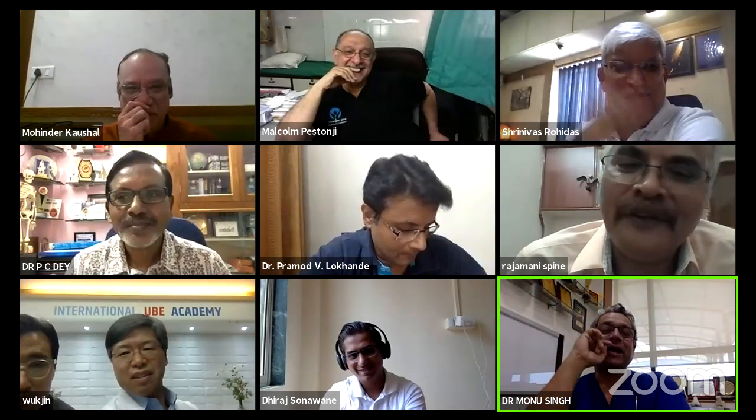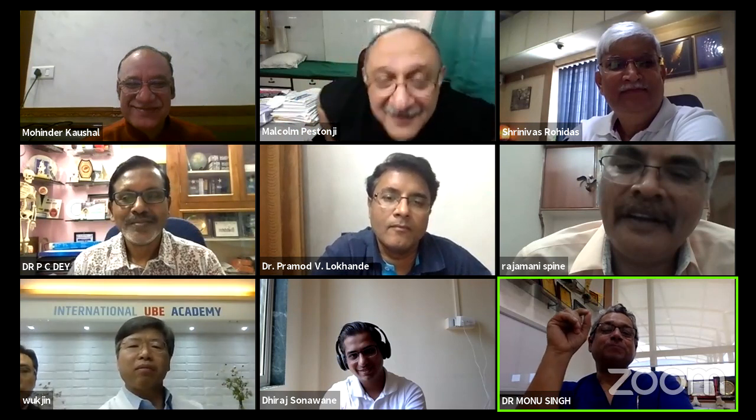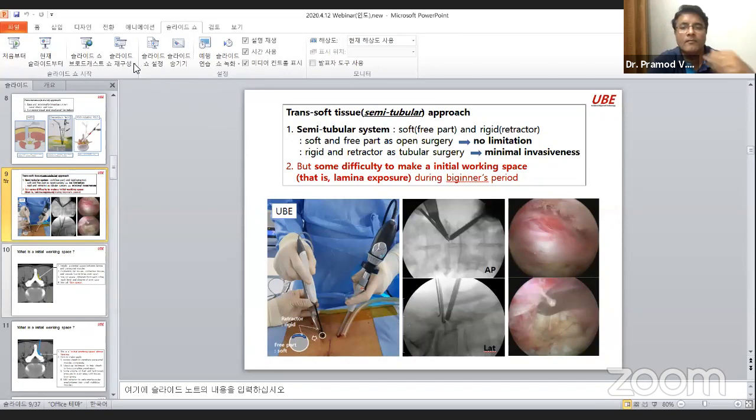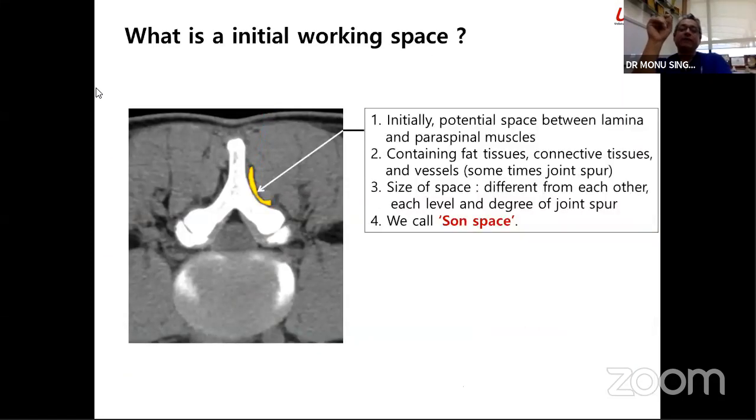I have a question, and this pertains specifically to Dr. Mahendar and Pramod. We are doing dry endoscopies, we are doing fluid-based endoscopies. And Dr. Mahendar has also modified his system to include a fluid-based endoscopic procedure. Where do we stand with the medium? What do you feel should be the ideal medium to use? And in which situations would we feel a dry endoscopy is better than a wet one, or vice versa? A few expert comments on this.